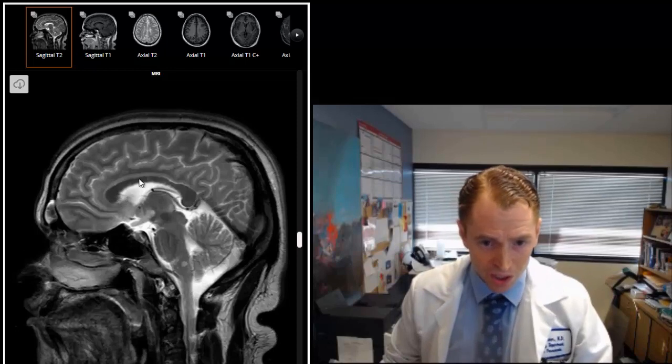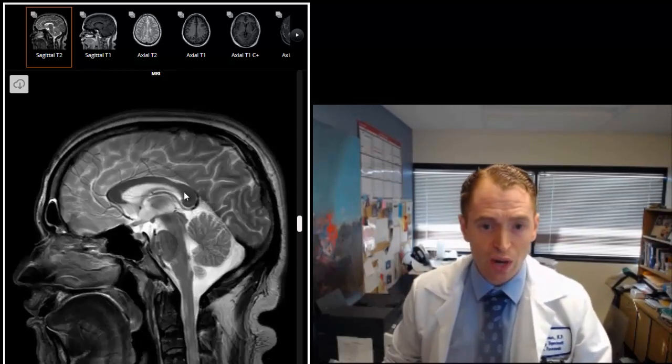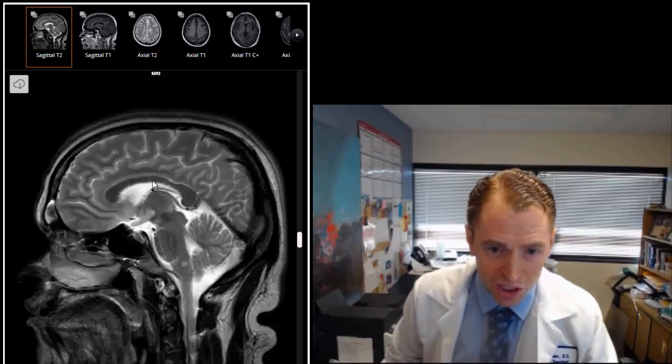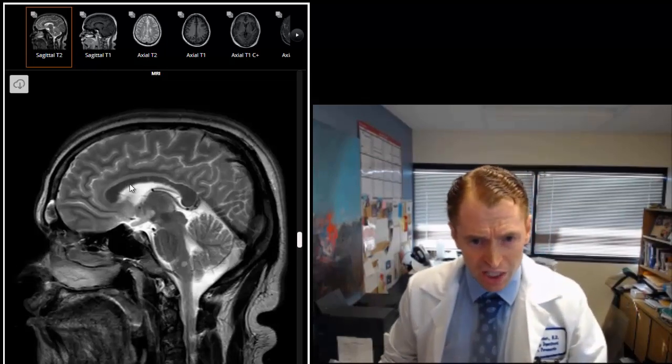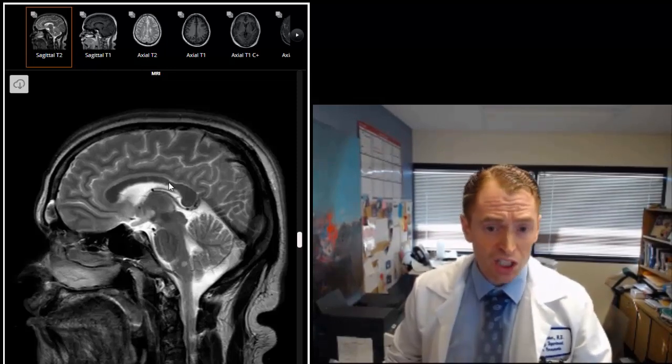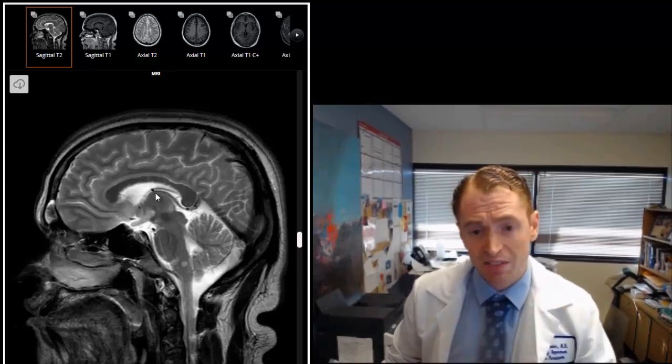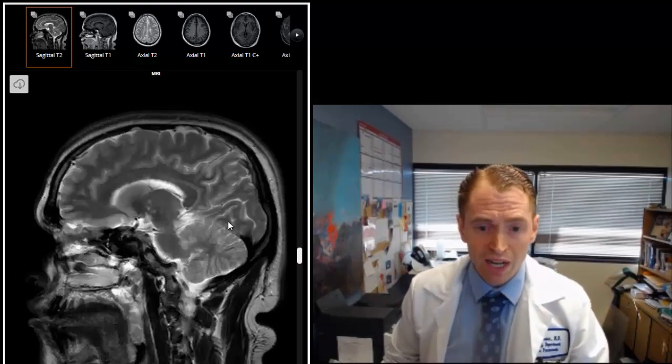This is the corpus callosum which is the white matter tract that connects the two halves of the brain. You can see there's some lesions in the corpus callosum. Lesions here often don't cause major symptoms although the corpus callosum is thought to be related to integrating multiple functions in the brain. People with a lot of corpus callosum damage and atrophy can have a lot of difficulty with certain aspects of cognitive function and multitasking.